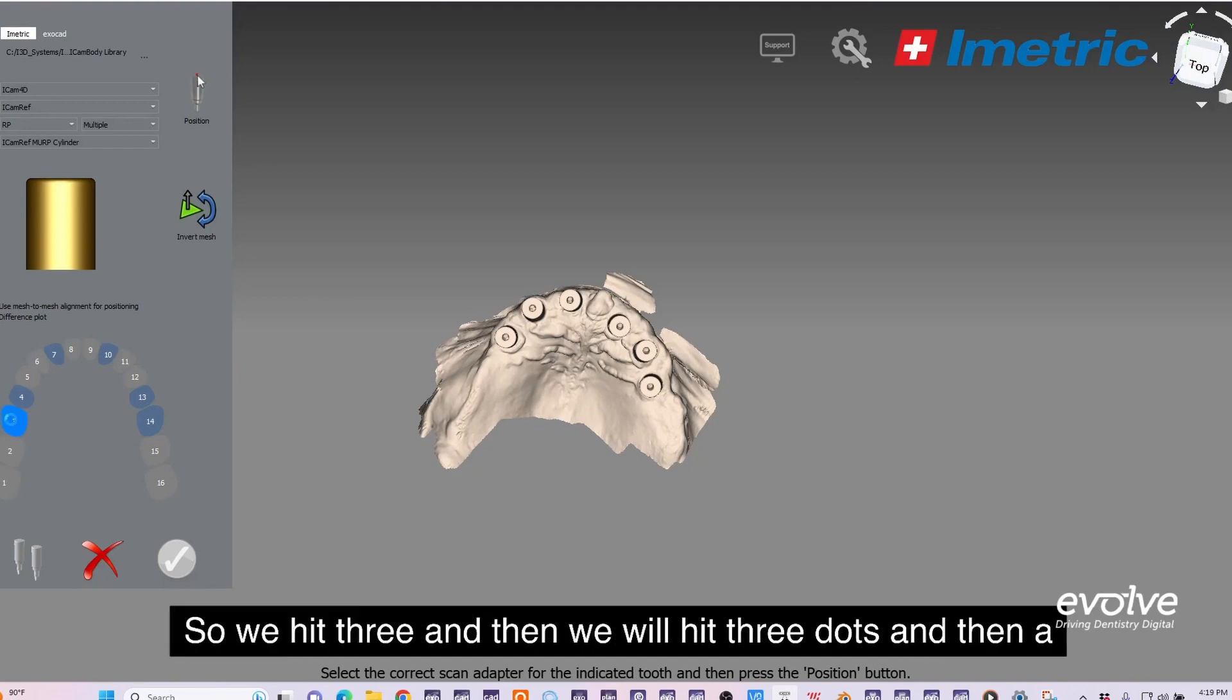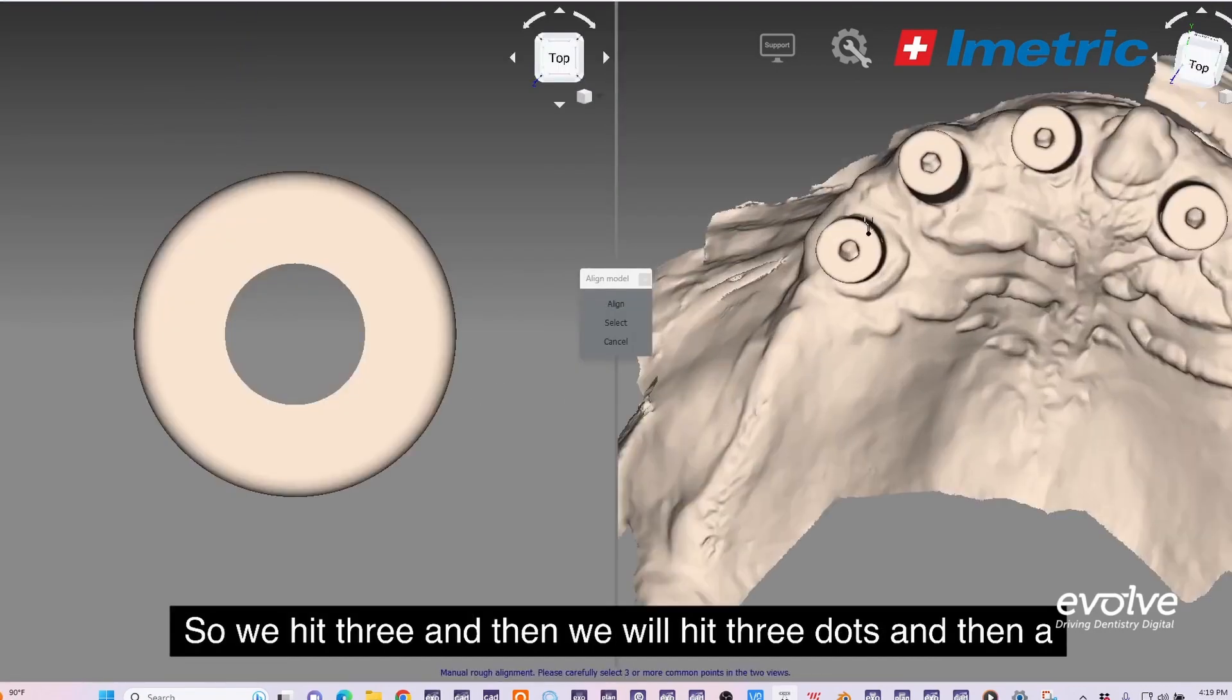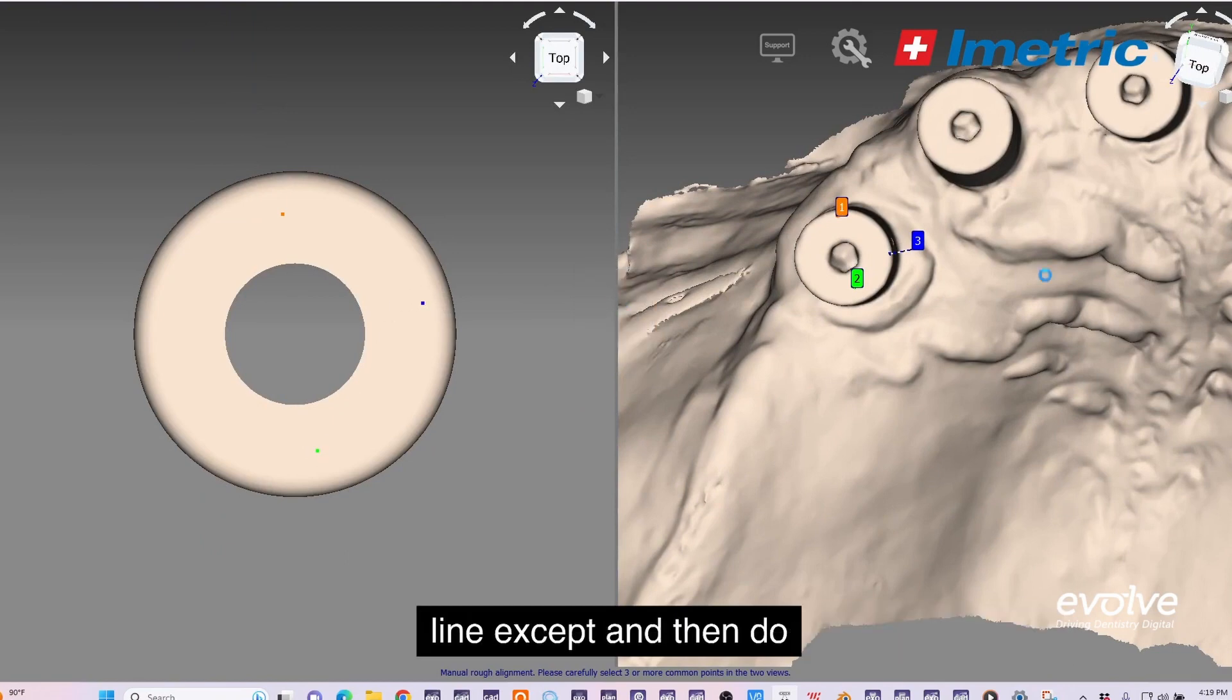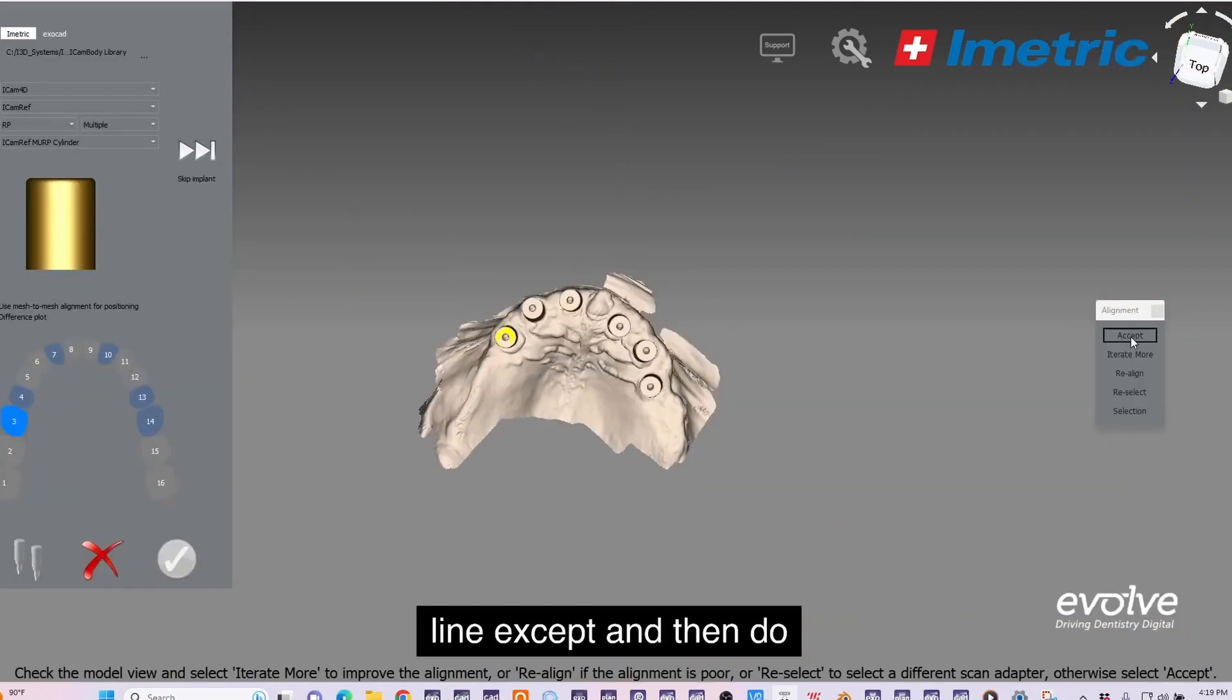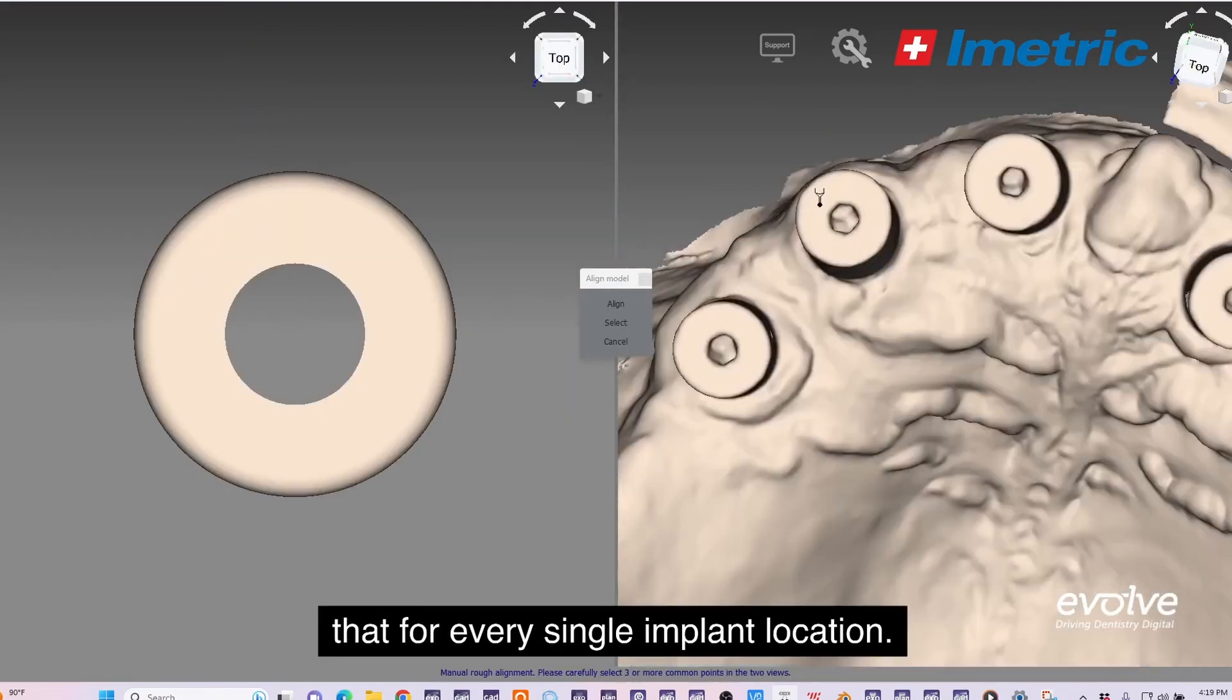We'll hit three and then we will hit three dots, then align, accept, and then do that for every single implant location.